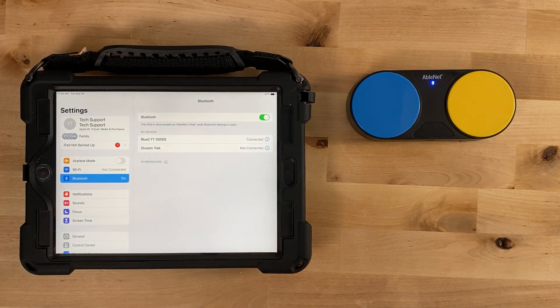The status indicator light will remain solid blue for approximately three seconds after your Bluetooth Feather Touch has successfully paired with your device.